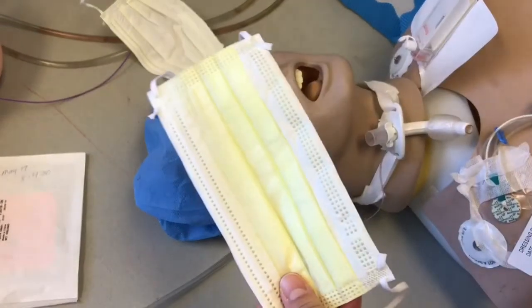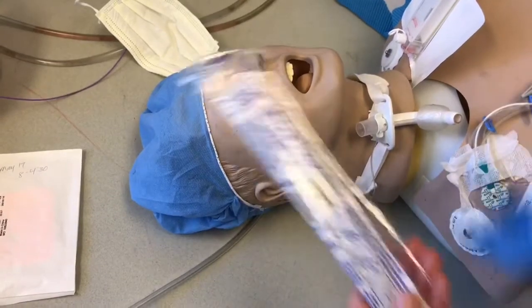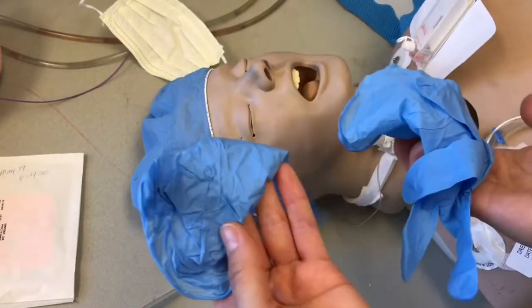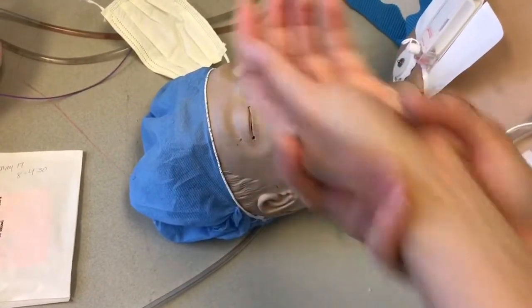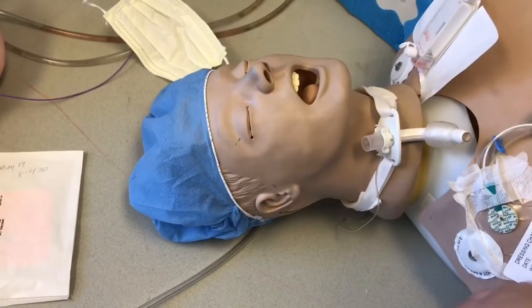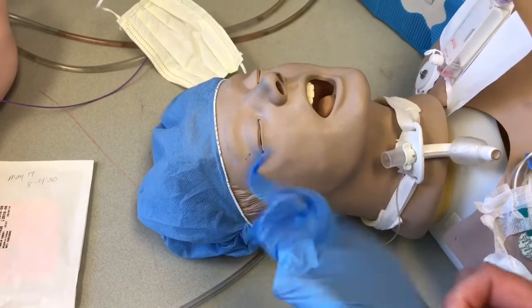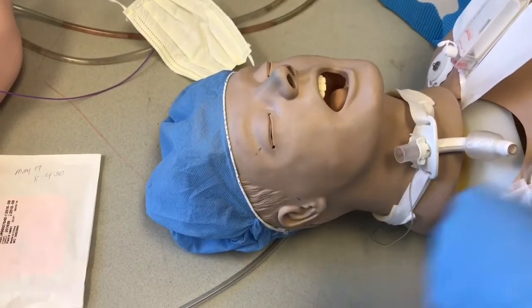How to perform a MRSA swab. Get your mask, get your kit for the MRSA swab, and your gloves. After you do your hand hygiene, rub, scrub, clean all around. Inform your patient what you're going to do. Get your mask on just for your protection, then put your gloves on.